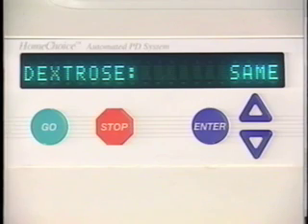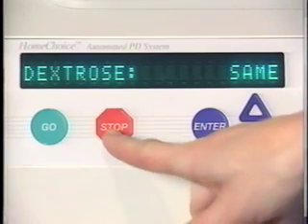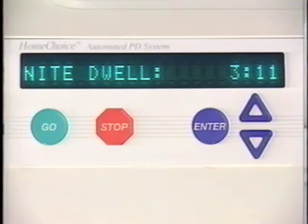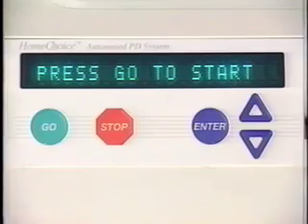If a last fill is required, the dextrose parameter must be programmed. This means the last fill volume may be the same or different dextrose as the other fills or a special bag. When the program changes are complete, press stop. This display will show the number of night cycles, not including the last fill and the night dwell. Then return to press go to start.